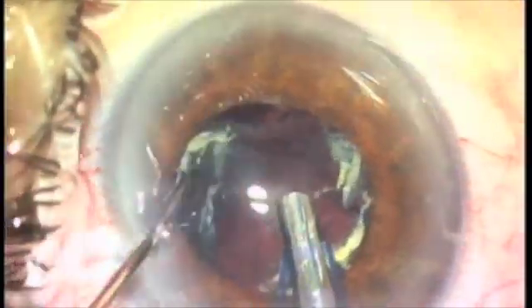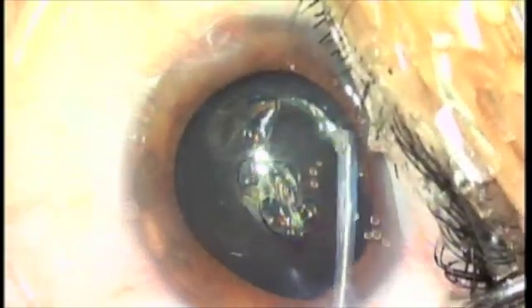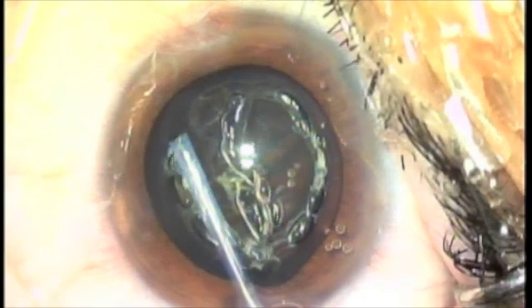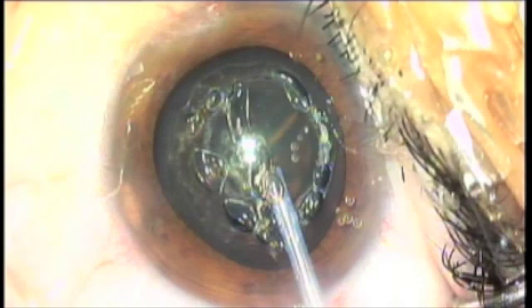Besides these more complicated cases, I could perform a very basic capsulotomy, and here it is. I'm gliding along the anterior capsule, creating a beautiful fugoblade capsulotomy — these are ideal. You can go in there and control those capsulotomies, and if I want to make it larger, it takes me a few seconds: I glide in there and I control the surgery.